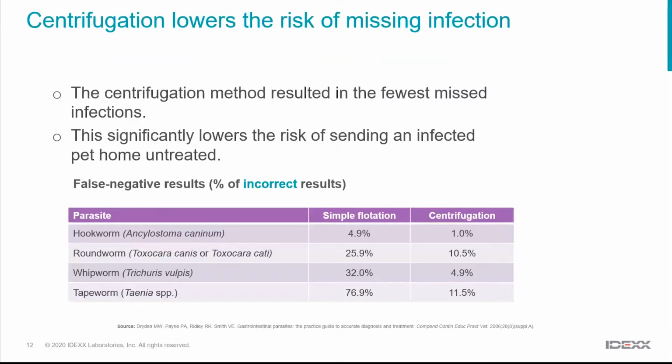This is looking at some data a different way. It's looking at the rate of false negative results, so where we've missed infections.